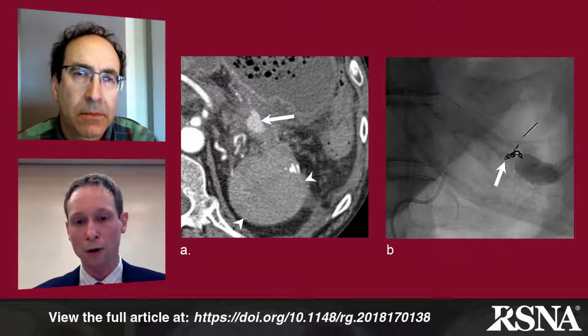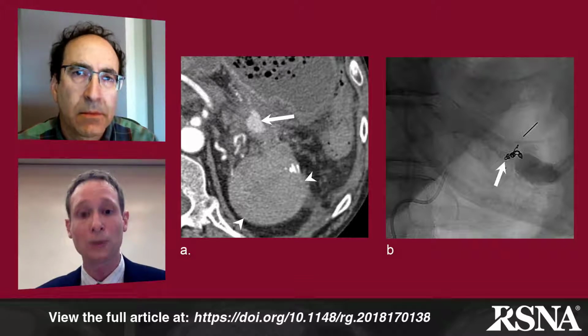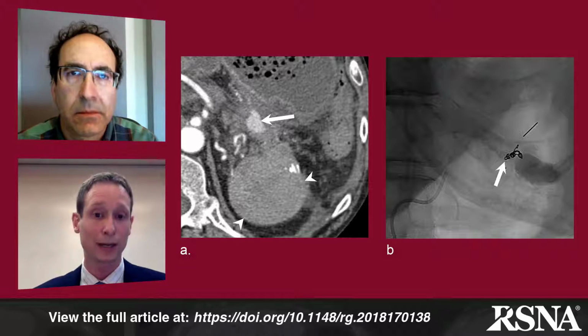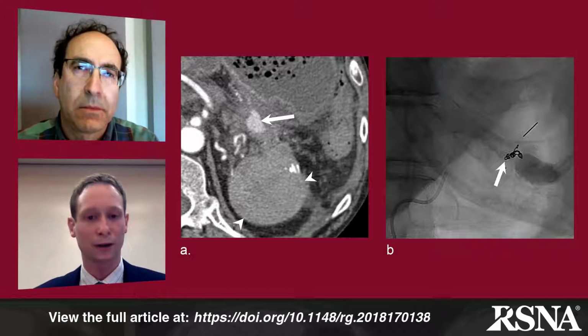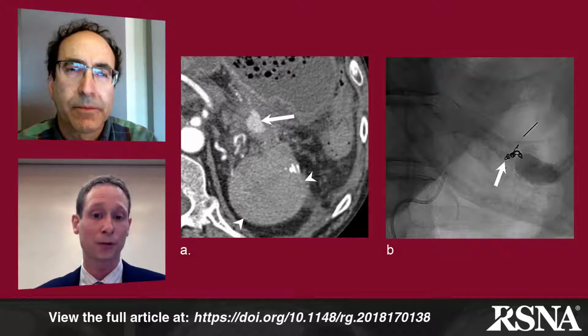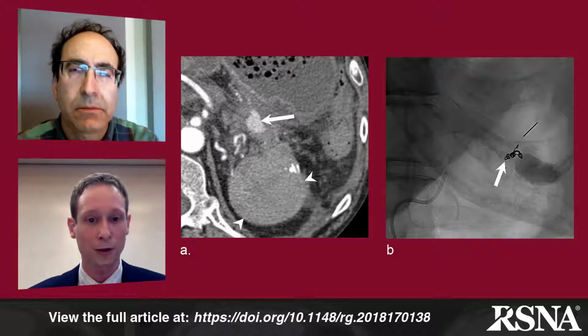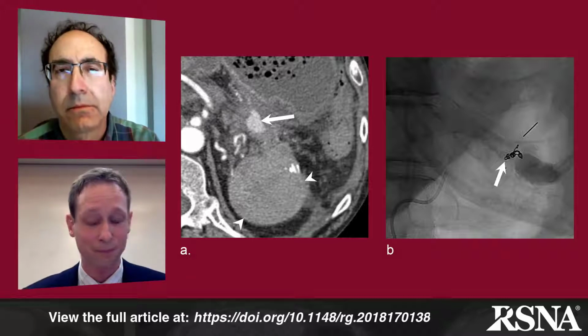For that protocol, the amount of oral contrast that people are administered varies by institution. We give people almost 2 liters of fluid here, and that takes about an hour to get in. And so in a rapidly bleeding person who could decompensate, we're not going to use this test to get a fast answer back to the clinician. But in someone who's relatively stable and who's able and willing to tolerate the oral contrast, CT enterography is a great choice to use even in an acute setting.